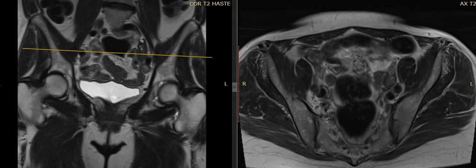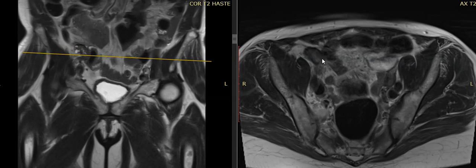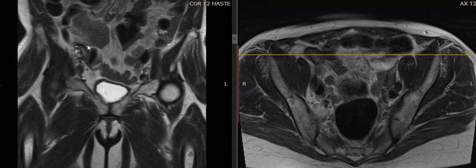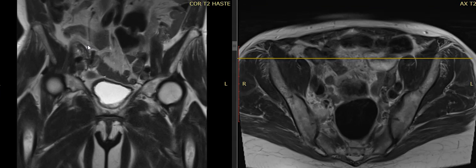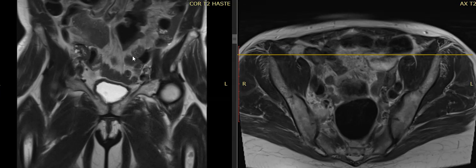On the right side, let's see if we can find it. It's difficult, but this is the right ovary right here — it looks ovoid. There's a loop of intestines swinging around, but there's the right ovary. The ovaries are not enlarged. I don't see an ovarian malignancy. So we don't see what they were talking about as far as ovarian pathology goes.